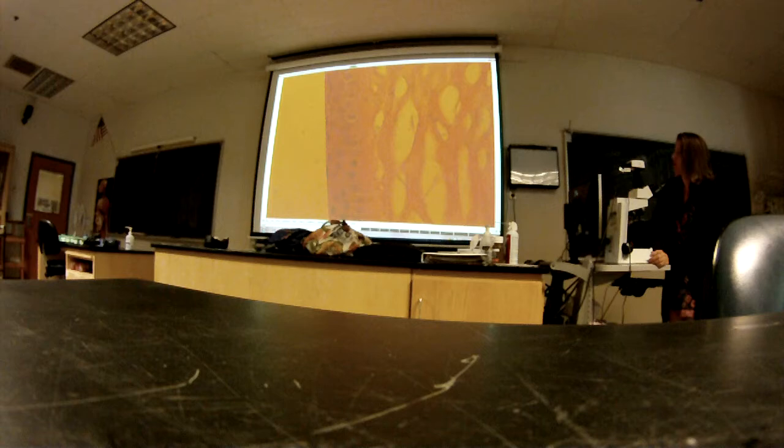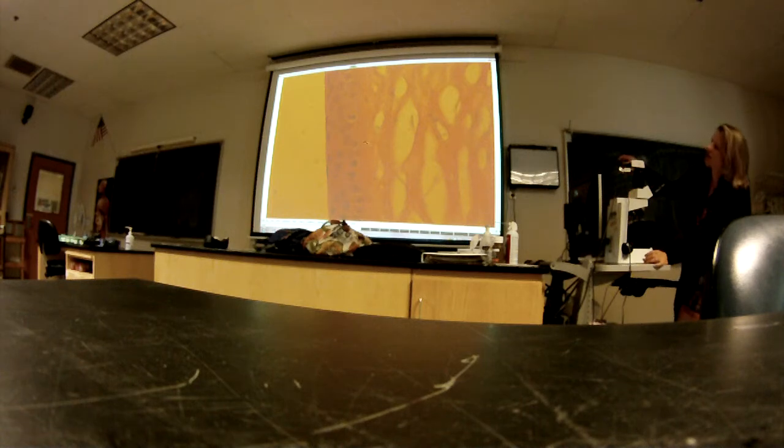It just said conjunctiva, but I want you to specify ocular. So there you can see the non-keratinized stratified squamous layer, the ocular conjunctiva.